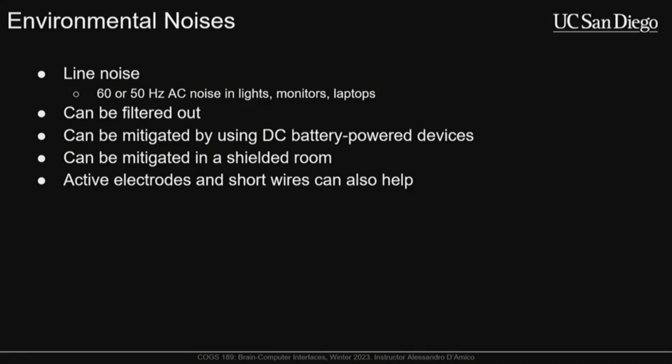And the easiest way to mitigate that, if you have no control over your environment, which sometimes we don't with these portable systems, is we just apply a notch filter, or we just apply a pretty aggressive low-pass filter after, let's say, 30 hertz, or a combination.